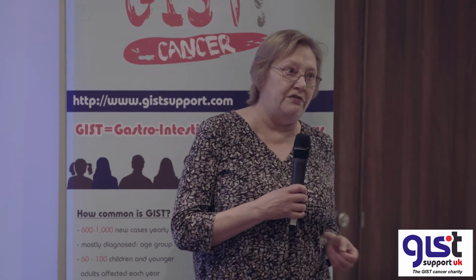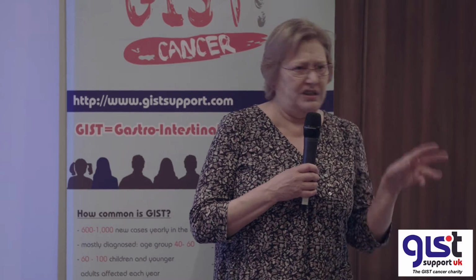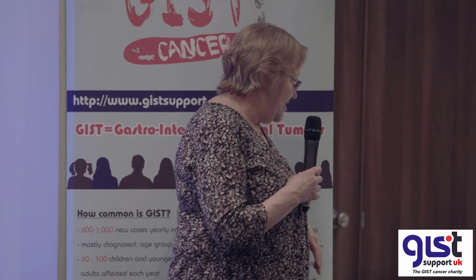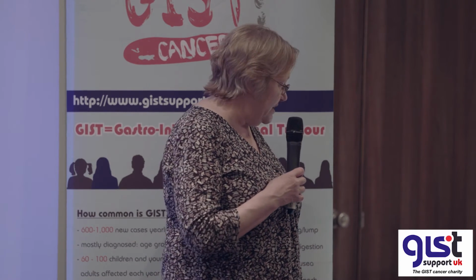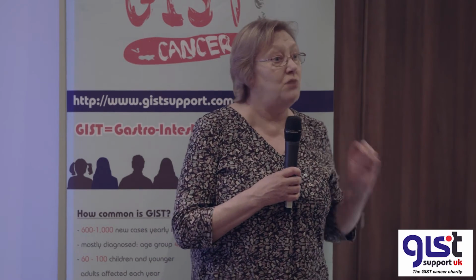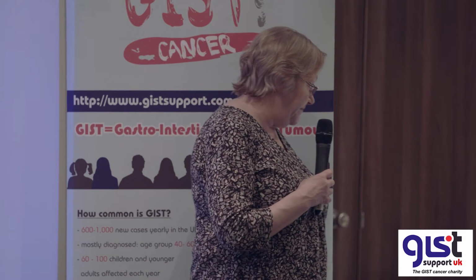It's not very specific, so your brain uses a lot of sugar, your liver uses a lot of sugar, your heart uses a lot of sugar, areas of inflammation and arthritis use a lot of sugar, but cancers do as well. So it'll pick a lot of things up, but it'll give us an awful lot of things that aren't actually cancer. That's one of the drawbacks with PET, but it can be a very useful technique, and we do use it as a general screen of the whole body sometimes to see if things are happening somewhere else that might limit our choices of what we're going to do.